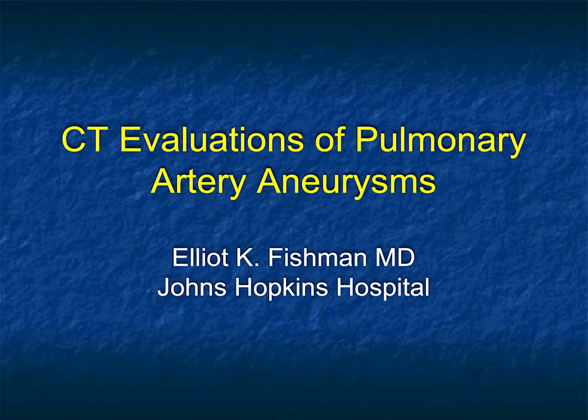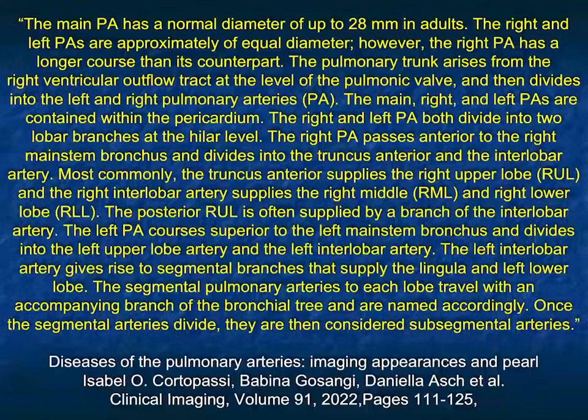This is going to be on the CT evaluation of pulmonary artery aneurysms. Now, we do talk about the pulmonary arteries a lot in CT, but most of the time we're talking about is there or is there not a pulmonary embolism present. We look at the pulmonary arteries also in patients with lung cancer. Occasionally, tumors can encase and narrow the pulmonary arteries. We also, at Case Conference, talk about rare pulmonary artery tumors like primary sarcomas of the pulmonary artery.